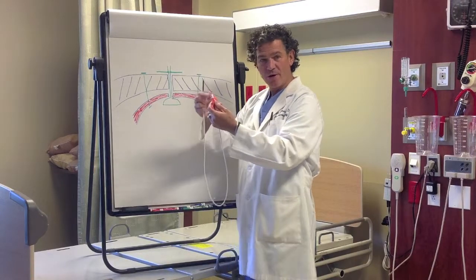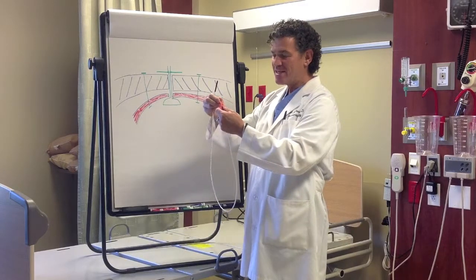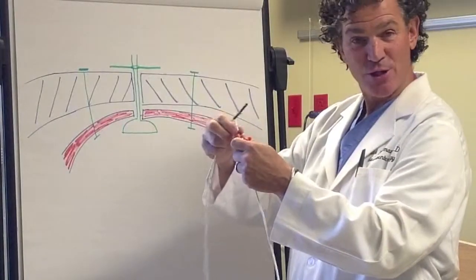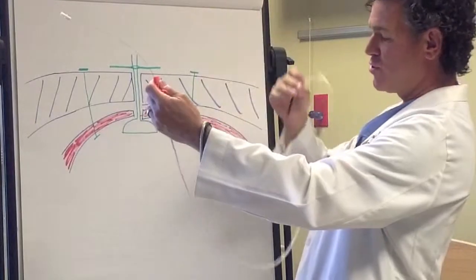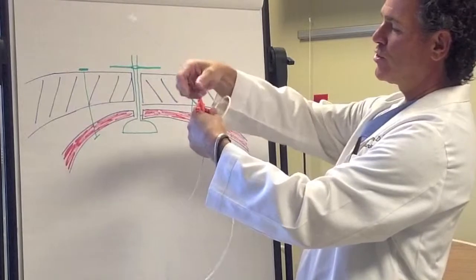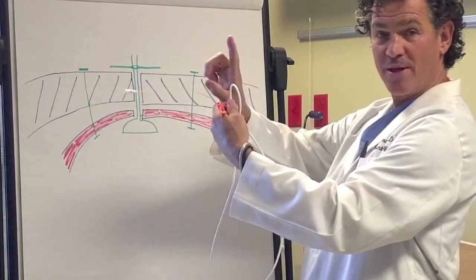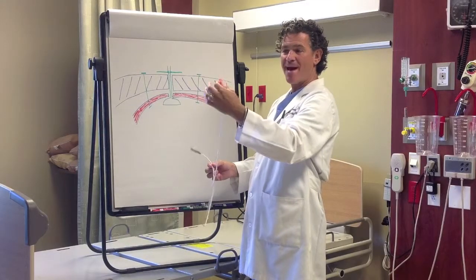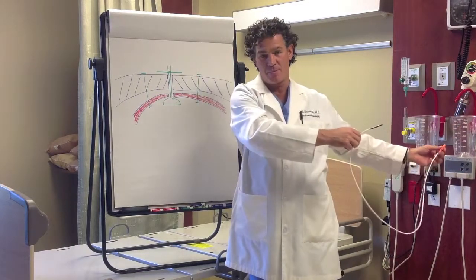You'll also hear that you never reinsert the guide wire. The reason for that is the tip of the guide wire is very, very small and it's relatively sharp, and if the guide wire is partly out and this tube is in the stomach and there's a kink in the tube, you can push the guide wire and actually have it come out the side of the tube and perforate the bowel. So if you're placing one of these and the guide wire should come out at all, this tube needs to be completely removed out of the patient's body.